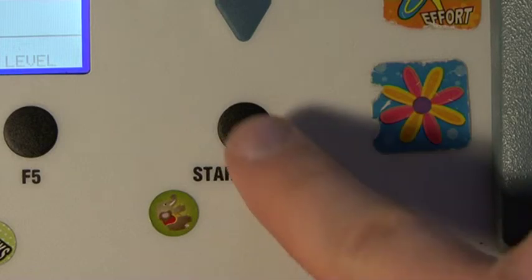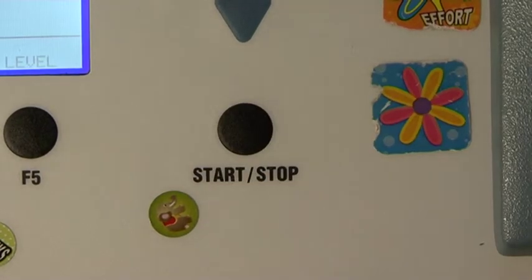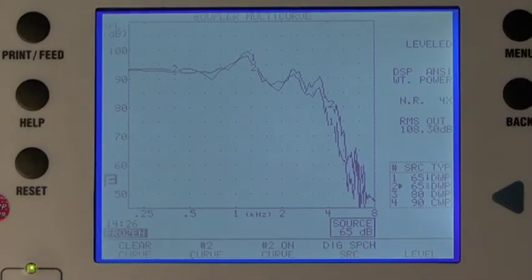Press start-stop to freeze the curve. You should have matched the level and shape of the hearing aid to the personal FM system.